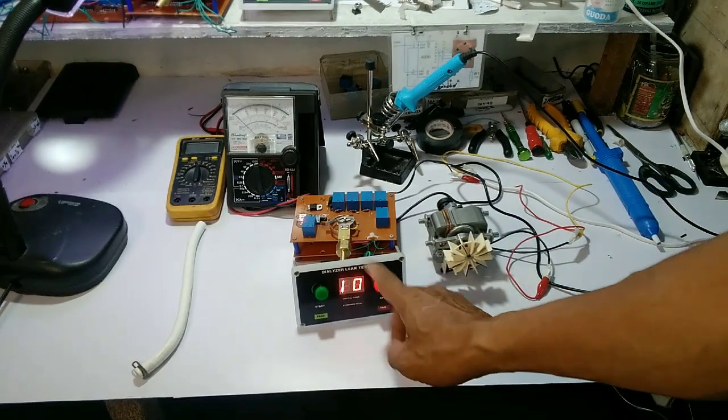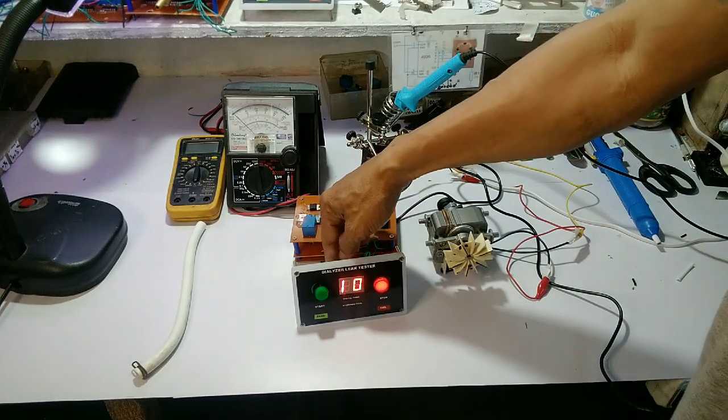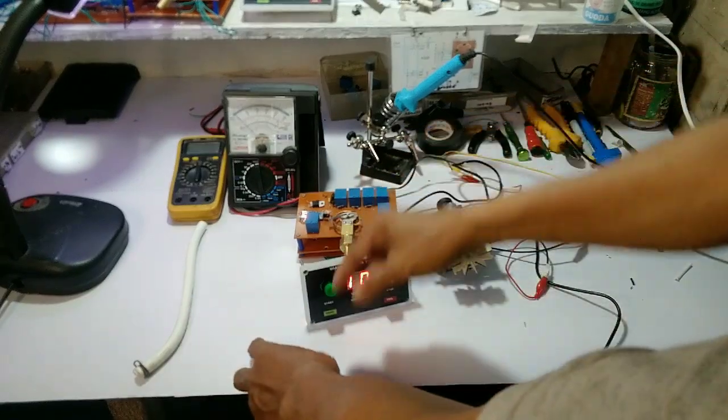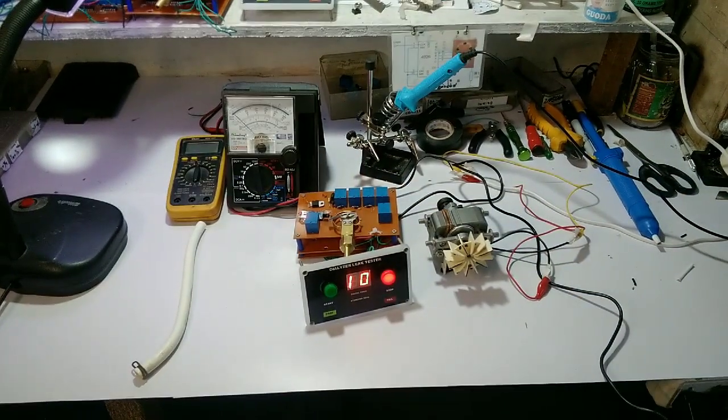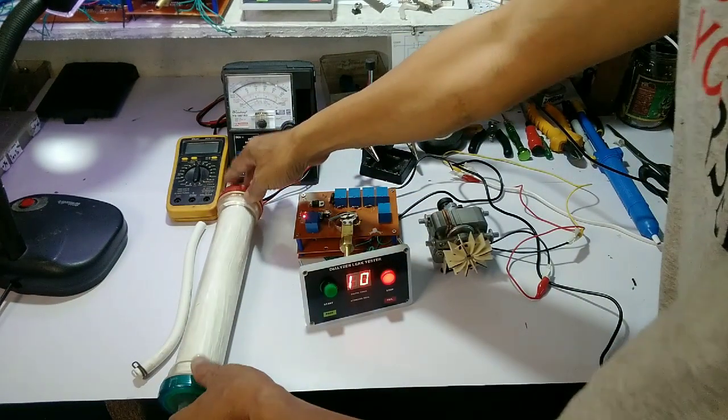Makikita nyo po, tumatakbo ang counter from 0 to 10 seconds. Pag milik ang dialyzer — ay po pala, ito po ang indicator. Dyan po pumapasok yung hangin galing sa air pump. Ito po ang ating dialyzer.